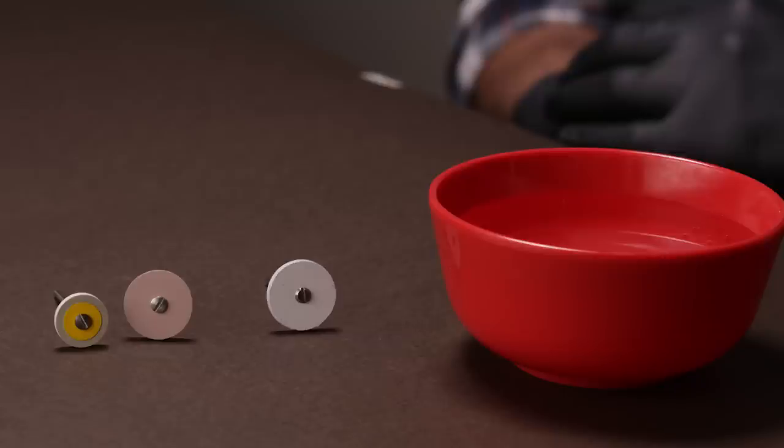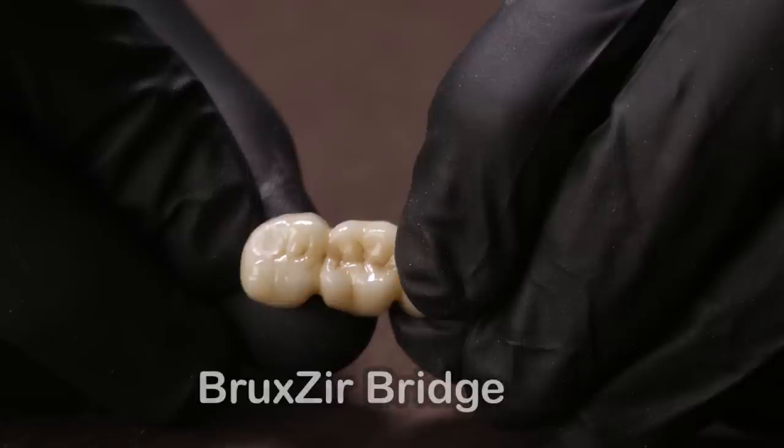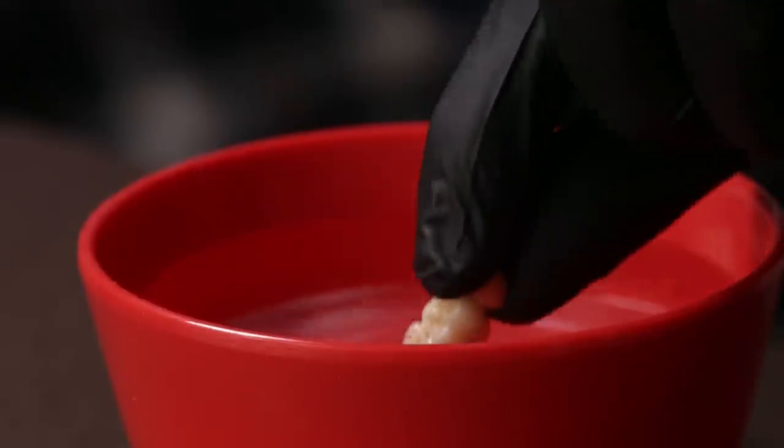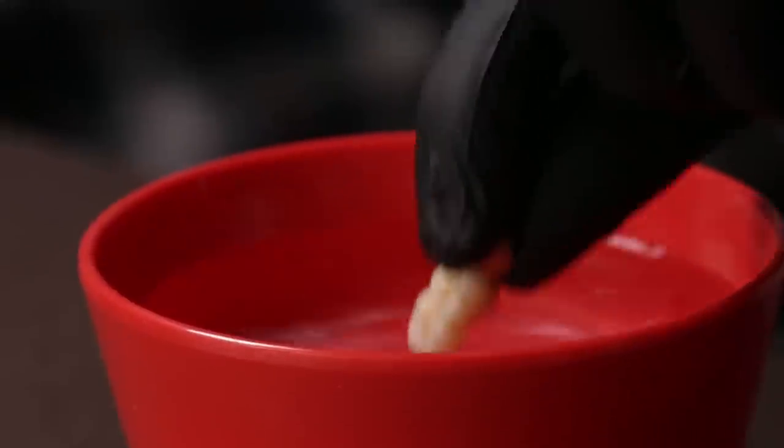Here's what you will need: a bowl of water, the three wheels from the kit, a micro motor, and the prosthesis you want to finish and polish. In this case I am using a three-unit BruxZir bridge which has been adjusted as per the patient's occlusion. You can see the rough area created with a burr while adjusting the occlusion. I start by dipping the bridge in water to prevent any frictional heat.